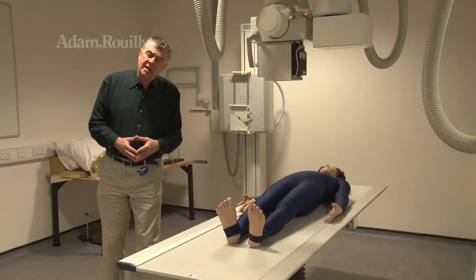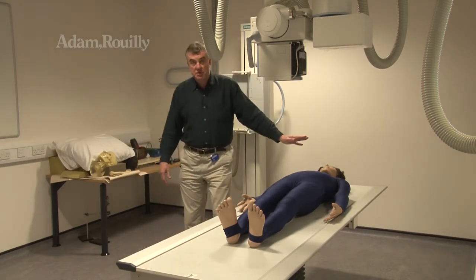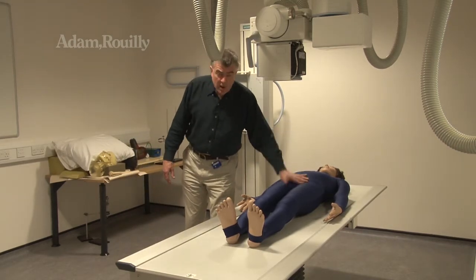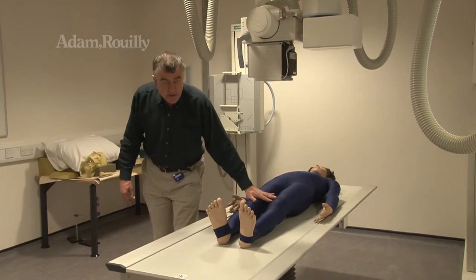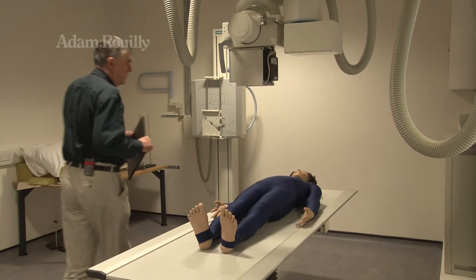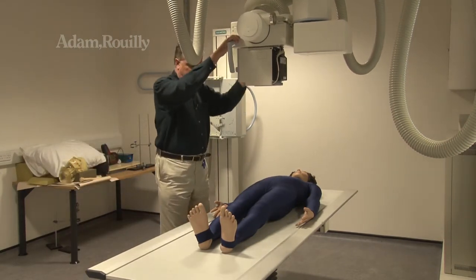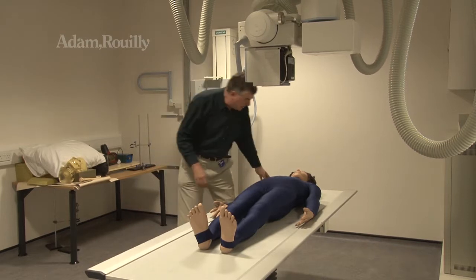So the images that I take will be of a skull, the head here, we will do the chest, we will do the pelvis, we will do the knees, and we will do the feet. The system we're using here is what we call computed radiography. There's no films anymore, it's all done digitally.